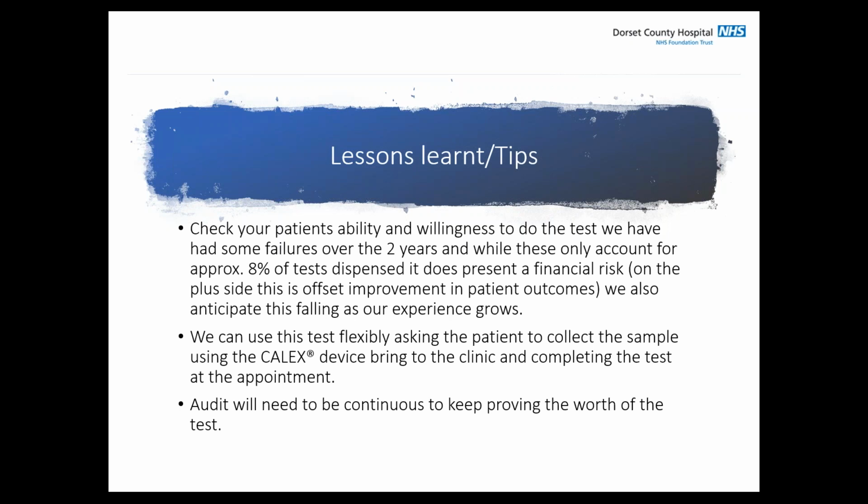You also mentioned that in the beginning you had some eager beaver healthcare practitioners that were handing out a bunch of IBDocs, and then a lot of them got wasted because the patient didn't do them. How many do you normally hand out to a patient when you first sign them up? We give them out one at a time. That's because we have to be sure that they're going to be used, and we can't have them sitting in fridges going out of date. I think we'd lose the service. I think we'd lose the ability to use it if we used them in any other way.